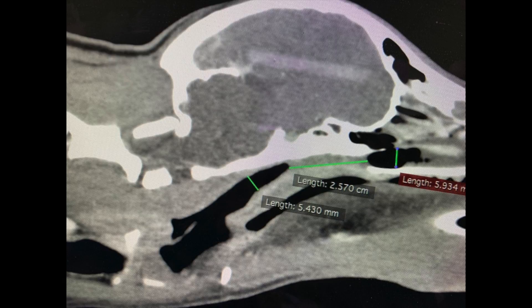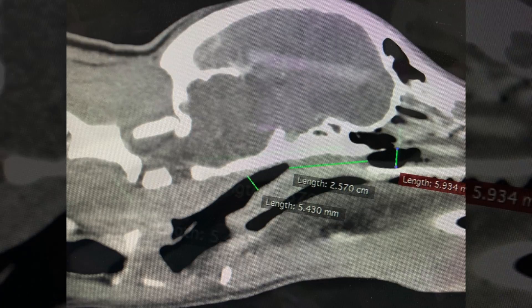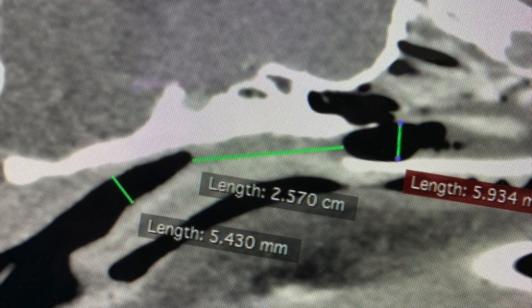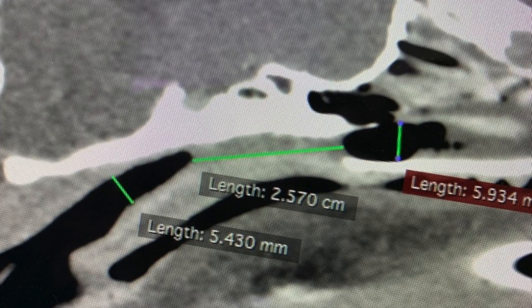In the middle of this sagittal CT scan we can see the length 2.57, which is the length of the stenosis. We can see that the normal nasopharyngeal lumen is about 6 mm in diameter.